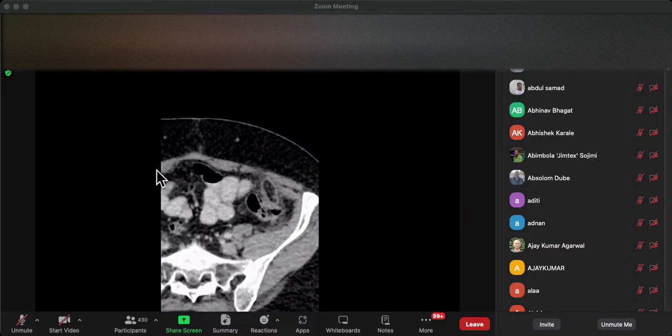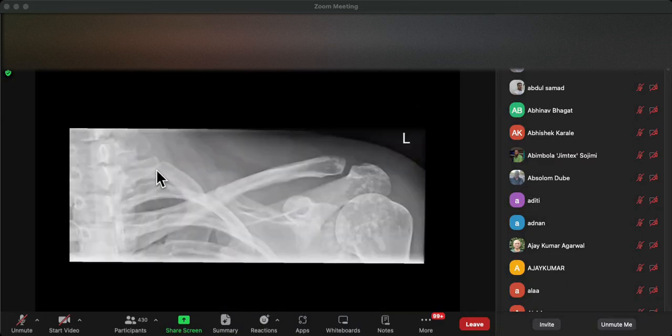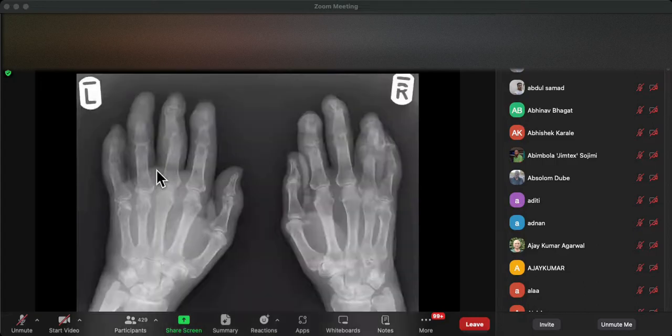There it is there. What's causing that calcification? Scleroderma, yeah, it's called calcinosis cutis. Osteopoikilosis, another case. That's what it looks like on CT, osteopoikilosis. Have a look at that.